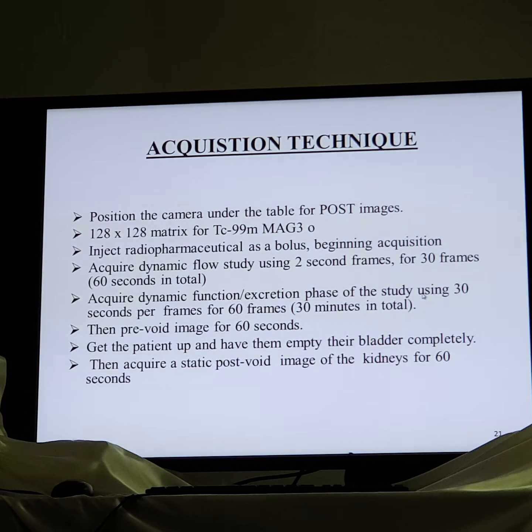Okay, scanning. I think all of you know how to scan for the renal scan. We use one camera head in posterior view, with matrix 128 by 128 for MAG3 and even DTPA. With iodine, we use 64 because we are giving the patients less dose.